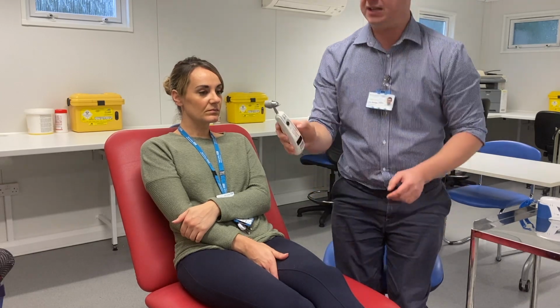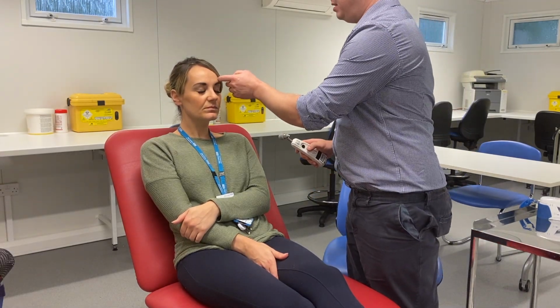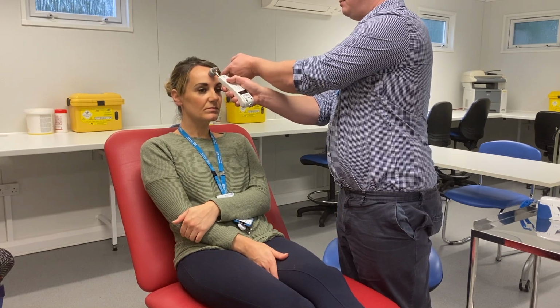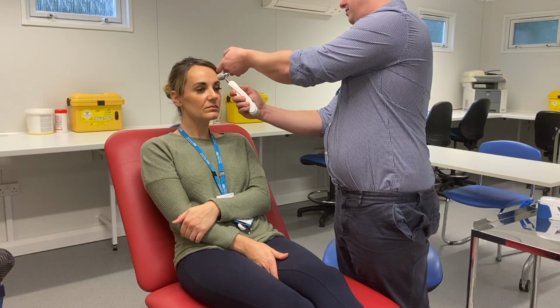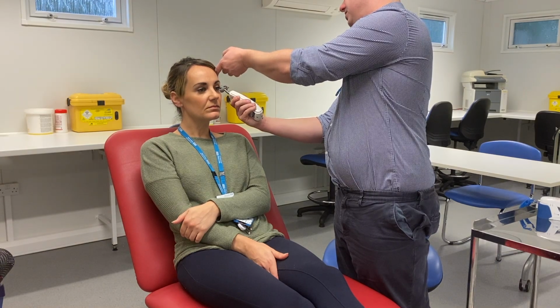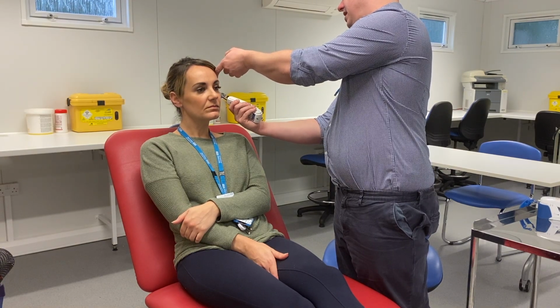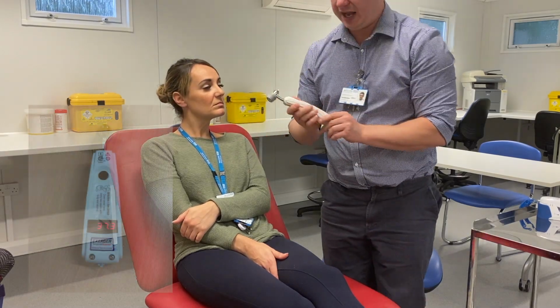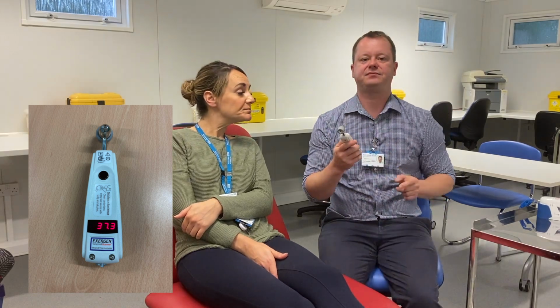And for this one, there's a big button on it, so we want to make sure that we move any loose hair out of the way, press the button, place the thermometer in the middle of the forehead. We can hear that there's fast pips, that means it's collecting information. Follow the temporal artery to the ear, keep the button depressed, place it behind the ear and release the button, and that gives us a recording there.